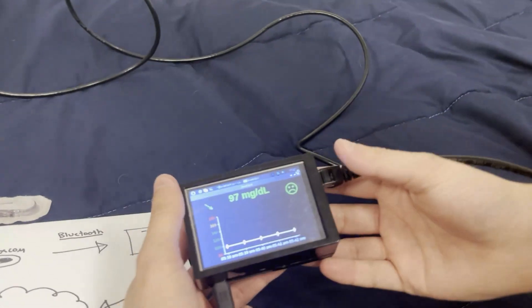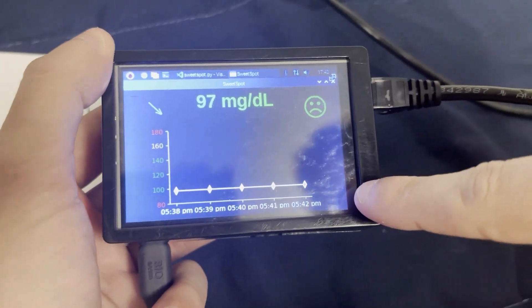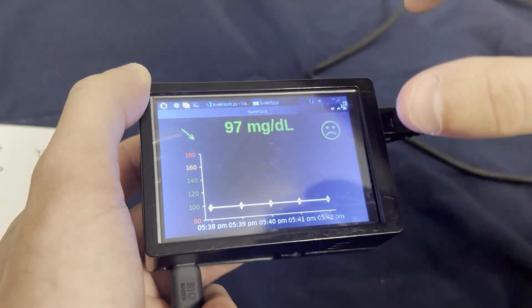And this right here is Sweet Spot. We take the five most recent blood sugar values, store them, and display the time, graph it, everything.